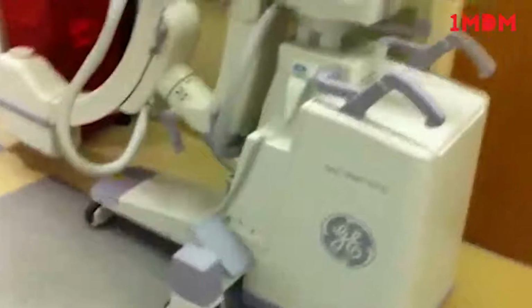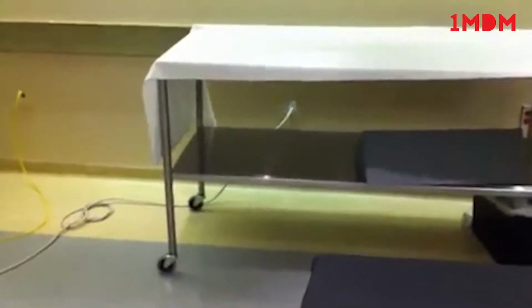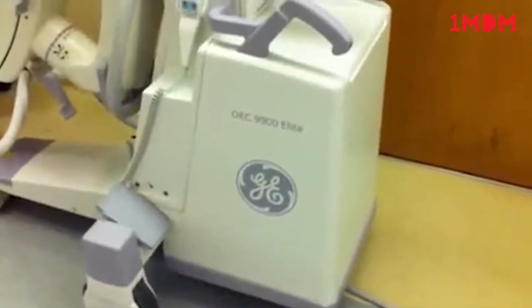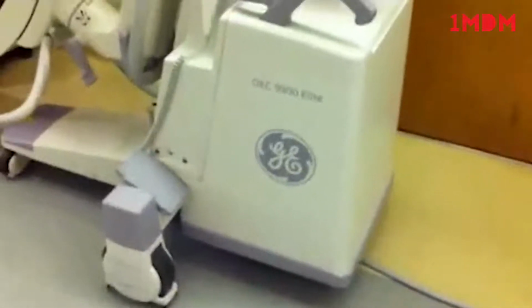It's a battery pack that allows the machine to generate high kVs, because I don't see how you can really get true high voltage out of just a simple little AC outlet, 120 volts at 15 amps. You can only do so much with a transformer. So the batteries inside this unit allow it to operate at higher kVs, kind of using it like a capacitor or a boosting battery.